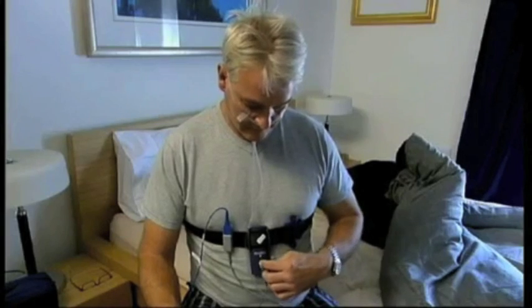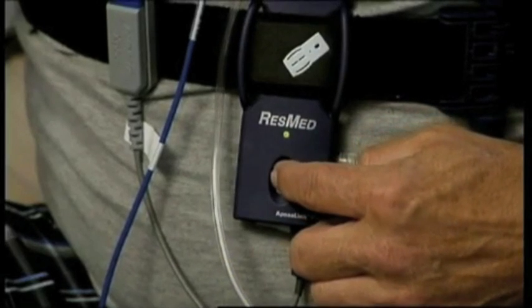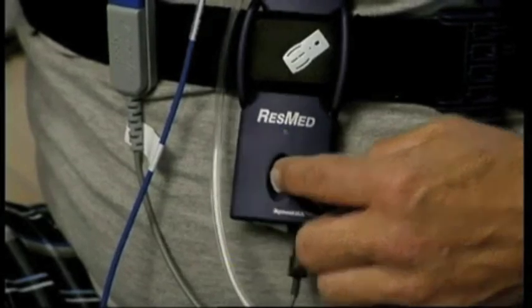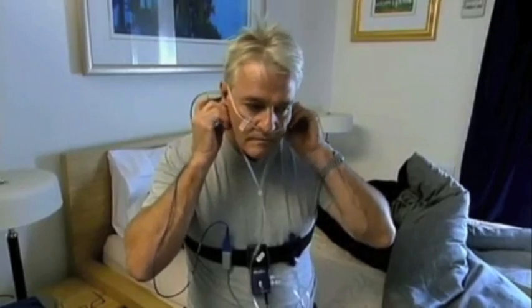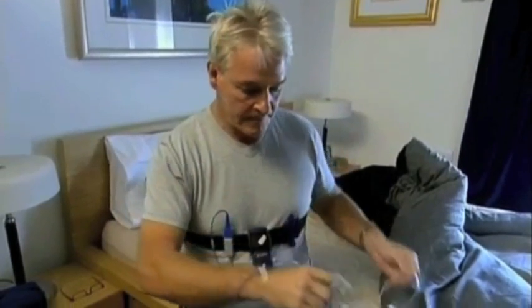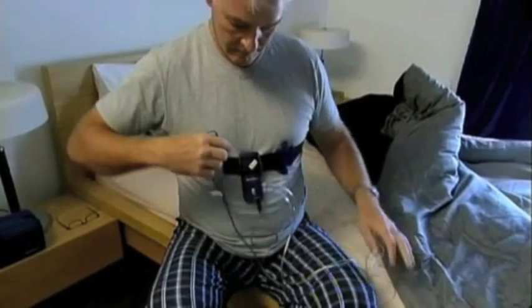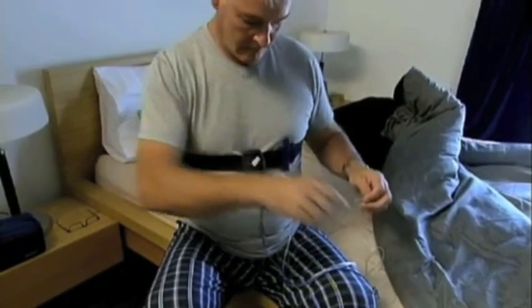When you wake in the morning, turn the recorder off by pressing the button until the green light goes off. This should take 1 to 2 seconds. Then remove the tube from your nose and the tape and sensor from your finger. Save all the components and return the ApneaLink Plus system to your clinician for analysis.